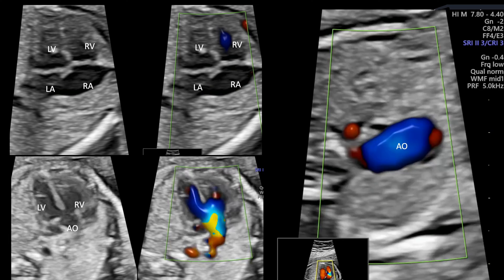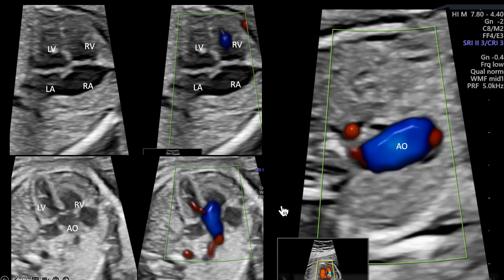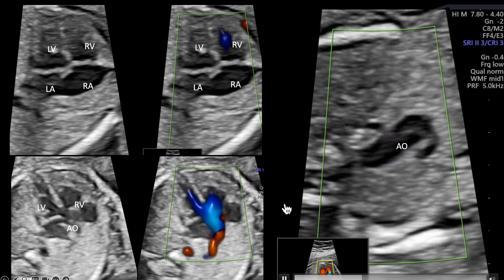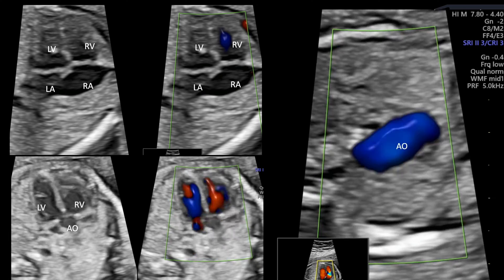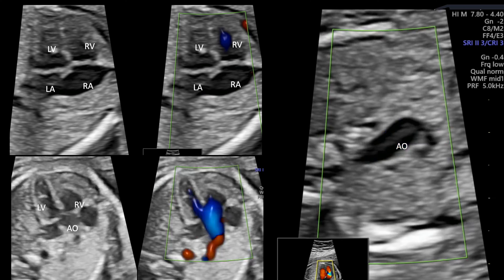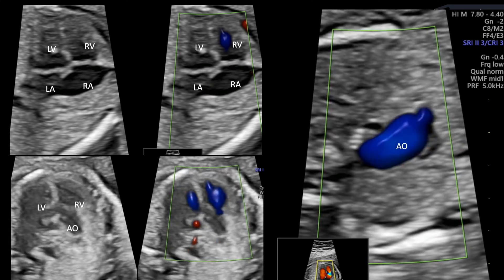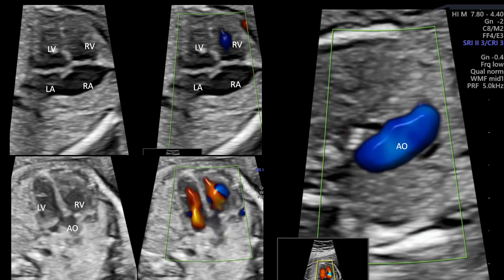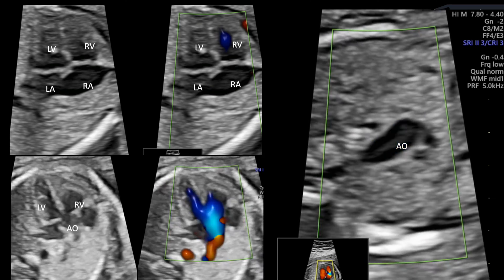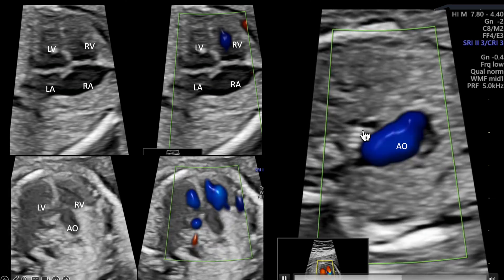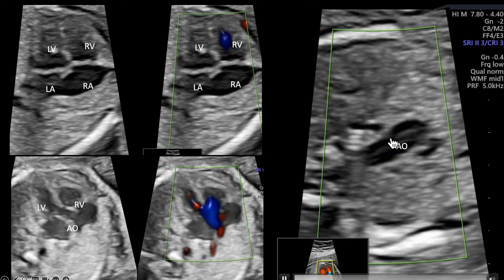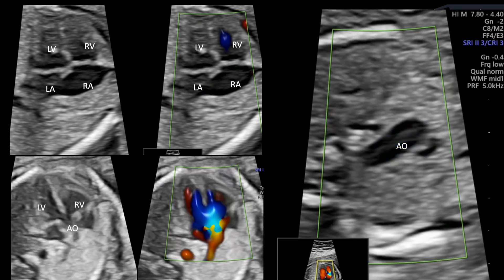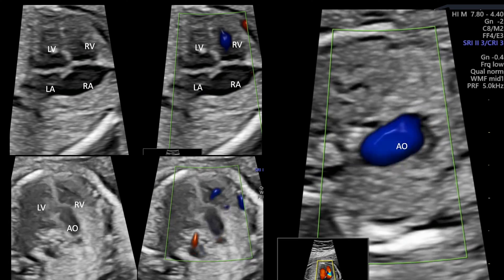We then go to a three-vessel view and you see what? You see a single artery — the second artery is missing. You see an SVC and you see the trachea, but you see only the aorta; you do not see the pulmonary artery.